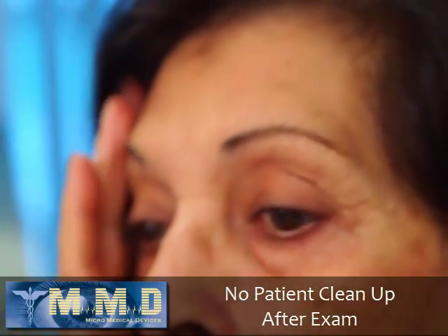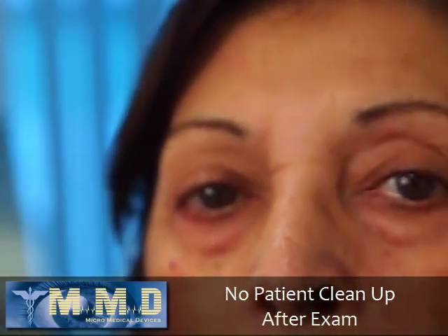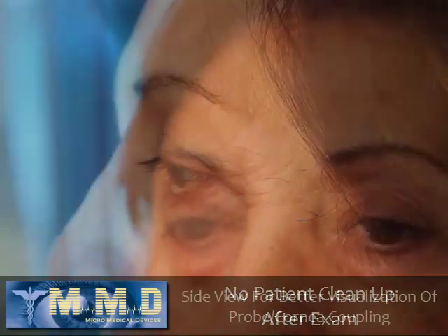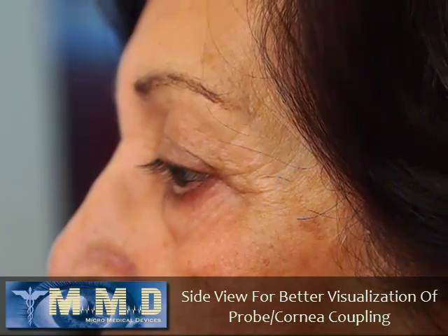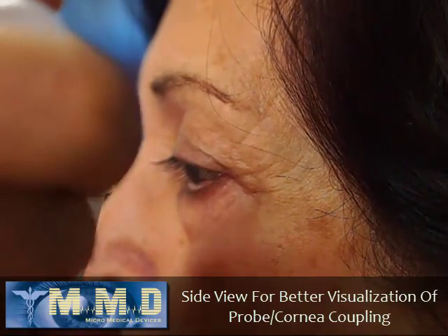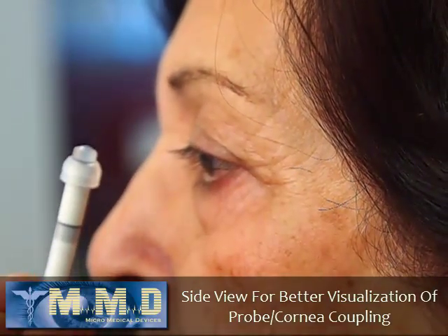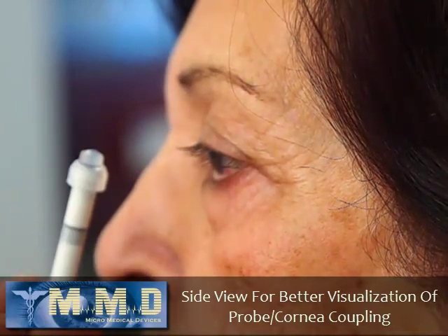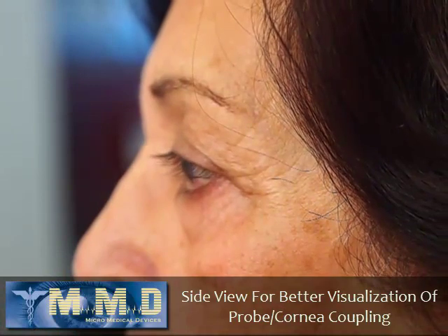Basically that's all it takes to do a successful immersion biometry without any mess on the patient. To scan the second eye, reintroduce half of the drop that was lost back into the meniscus on top of the Easy Immersion Tip, and at that point you're ready to scan.